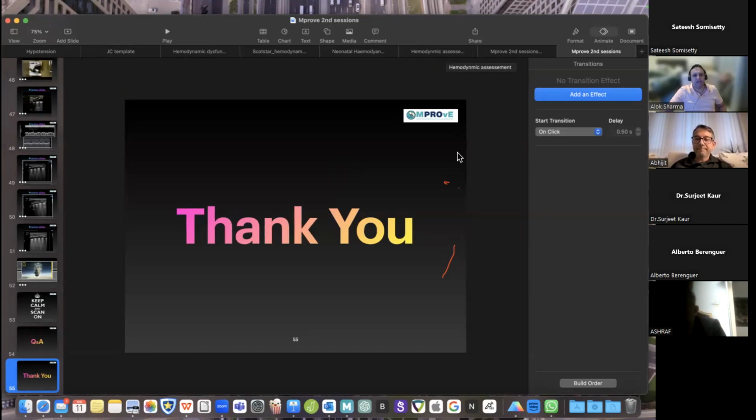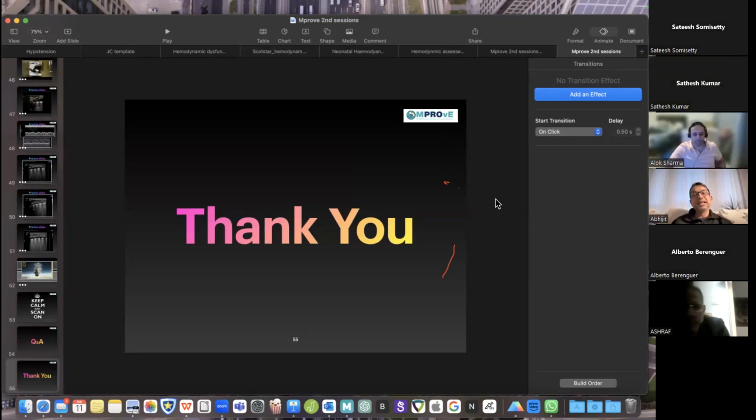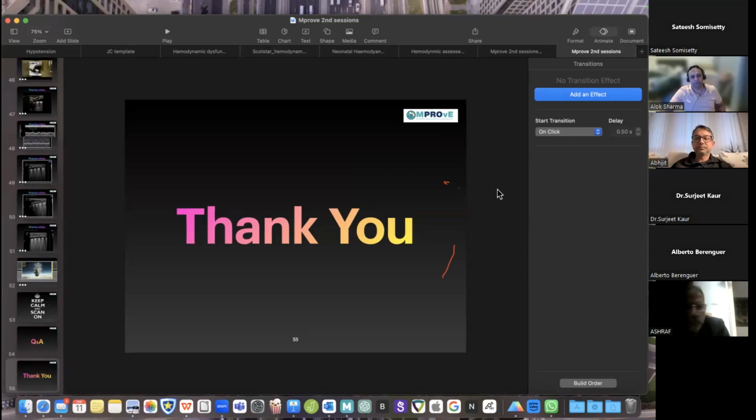Lovely. We've got Satish's hand raised. Satish, please go ahead. Thanks, Abhijit, for the excellent session. My question is, when you do the interrogation by color Doppler, whether it's consolidation or not, what should be the ideal color scale? Because on the different slides you have shown, the color scale was not the same.